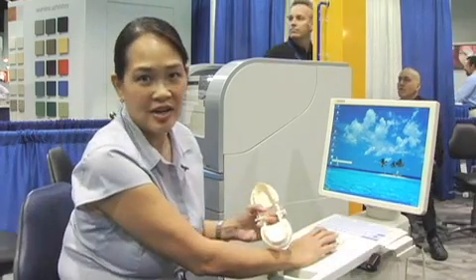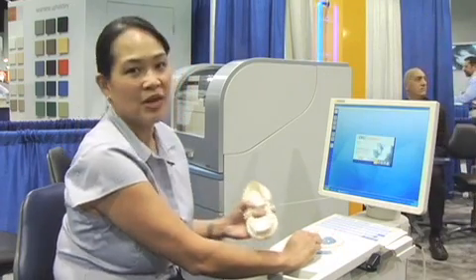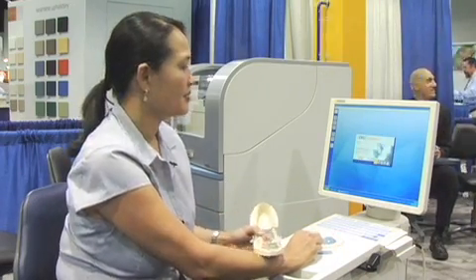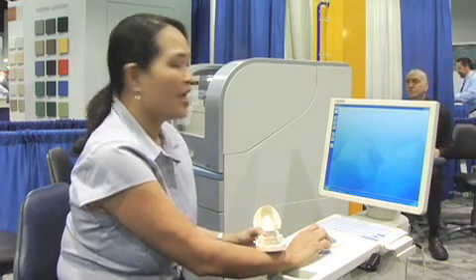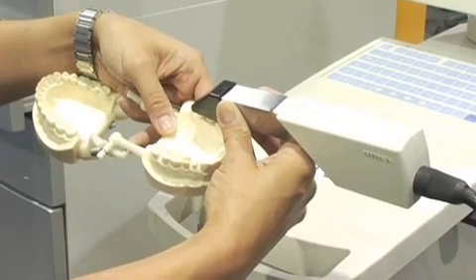So you click on the CEREC Connect icon, wait for it to load up, and then we're going to be doing our new patient. We're going to be acquiring the images for the preparation.